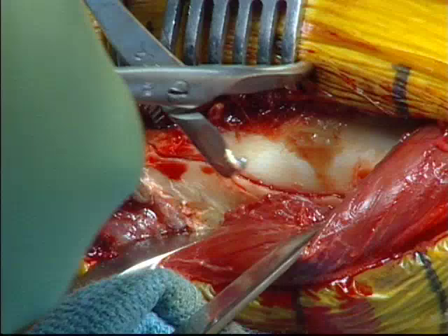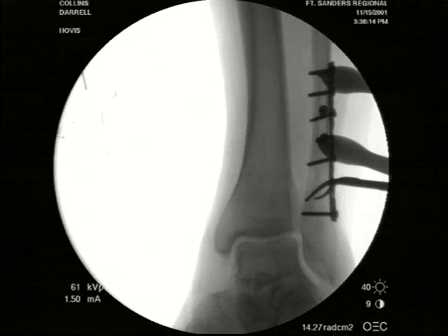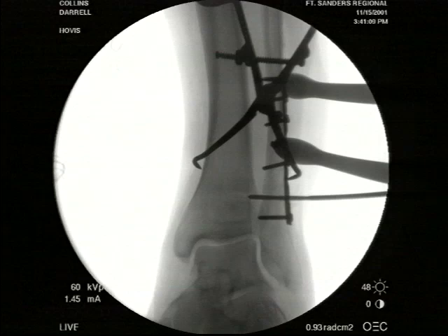There we go — and it falls into place. Getting rid of that hematoma and the fractures is the key to trying to get that anatomically reduced. On stressing the fibula and the syndesmosis, it appears there's a widened tibial fibular clear space. The ankle has reduced well with a normal appearing mortise.